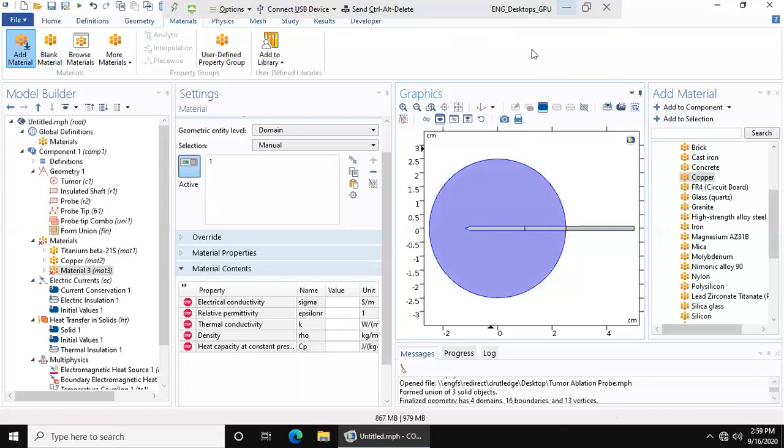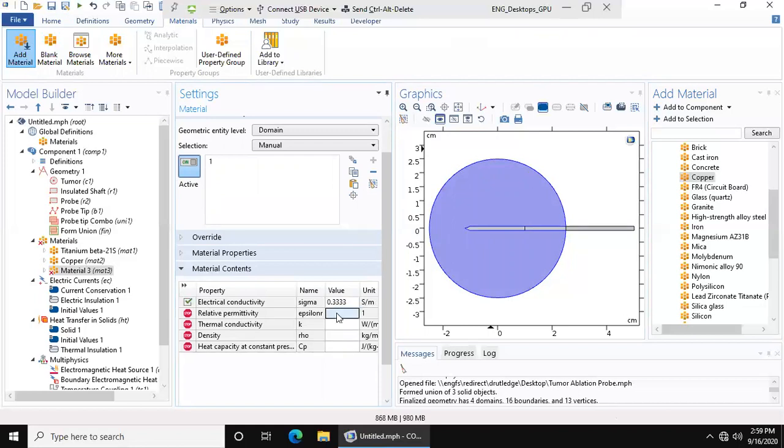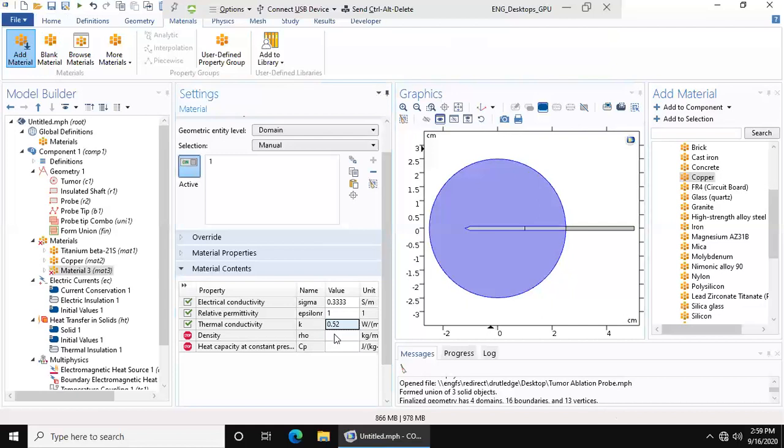The properties that we are going to enter are 0.333, one-third however far you want to make that go out. The relative permittivity is 1. Next is k, which is 0.52, the thermal conductivity. Density is 1079.